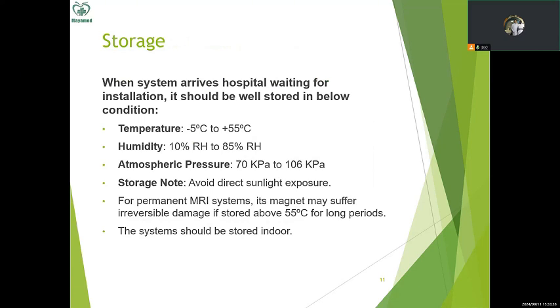Okay, after sharing some bad cases, we are now going to see how we should store the imaging systems like CT, MR or DR when the system arrives at the hospital but before the installation. When the system arrives at the hospital waiting for installation, it should be stored in the below condition.